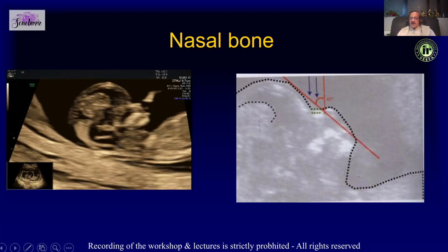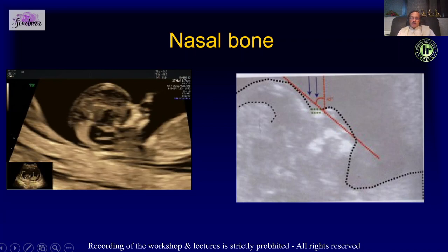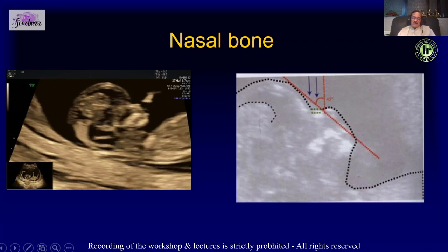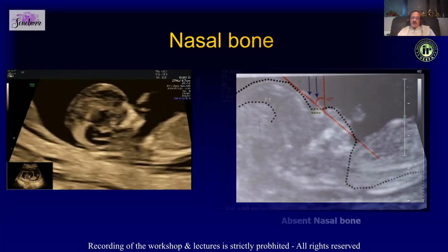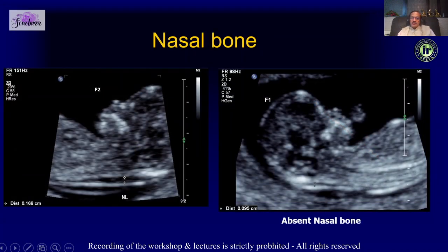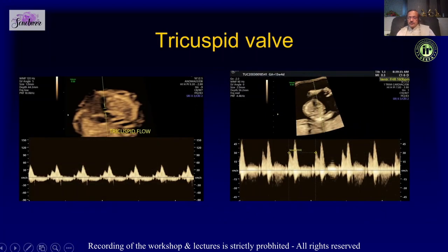The bright line below is the actual nasal bone. In the first trimester we are typically looking out for the presence of nasal bone — we need not measure it, unlike in the second trimester.